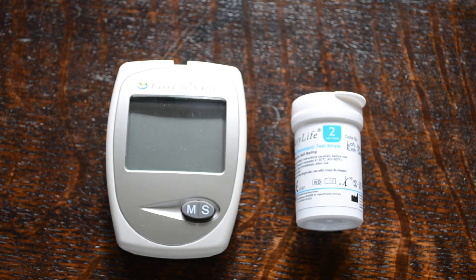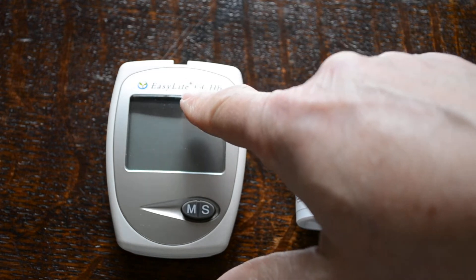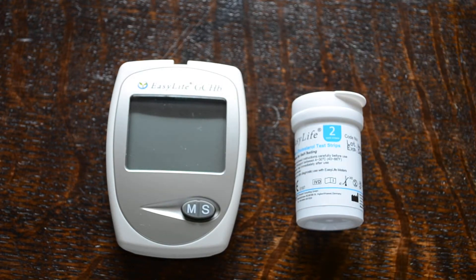In this demonstration video we're going to show you the EasyLife triple meter. The triple meter function in this particular case, as shown on the front of the meter, is glucose, cholesterol and haemoglobin. We're just going to show you the procedure for selecting a cholesterol test to be performed by this meter.